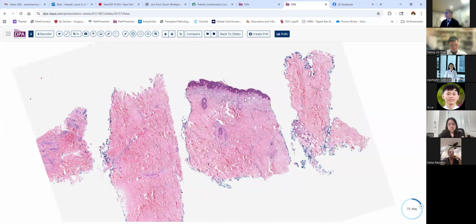And then as we look at the depth of the dermis, we've got a papillary dermis up here, not much solar damage. And then we've got a dermis that's thicker than our biopsy. Here we're down several millimeters. So this is most likely going to be someplace on the back or trunk, where you're going to have a thicker, more durable dermis.